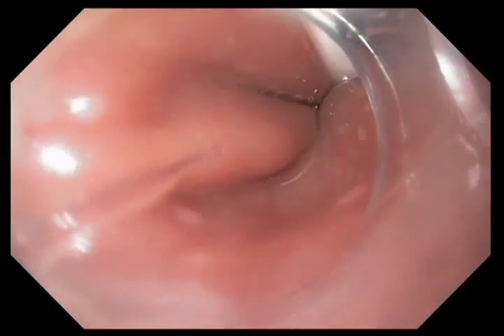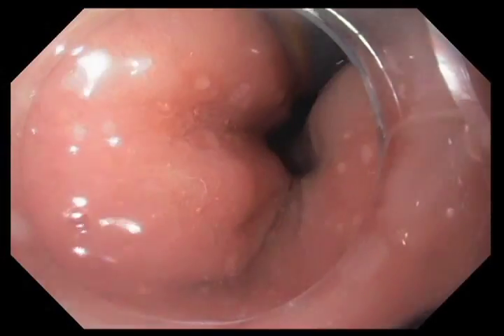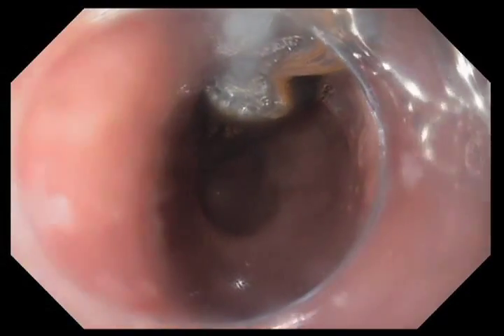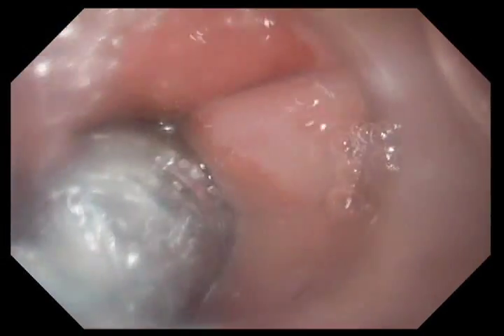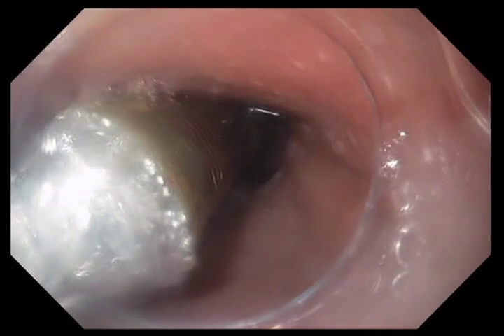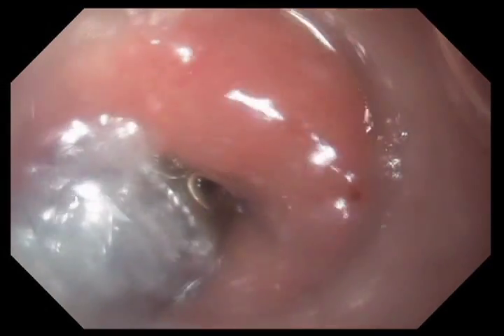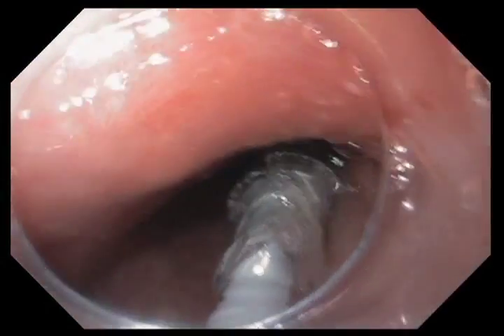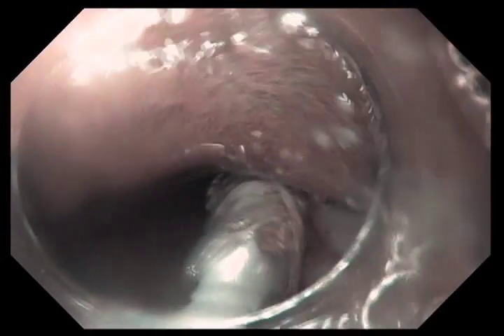We're currently using white light, but you can see the white catheter probe adjacent to the esophagus. We're pulling back on the treatment balloon and you'll see the balloon itself — there it is. You'll get a close-up view and you'll see these copper-colored rings at the 2 o'clock position. Those rings are the area of treatment. We put energy through those rings, and the spacing of the rings and the amount of energy produces a coagulation necrosis to a certain depth.